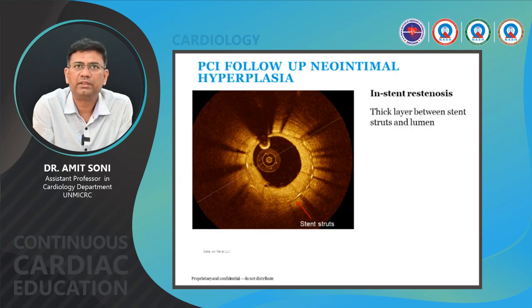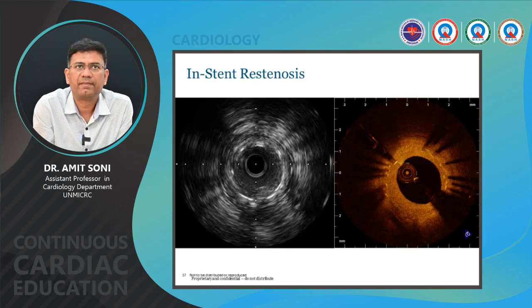In-stent restenosis: a thick layer between the stent and the lumen. So this is suggestive of in-stent restenosis. So this is another picture of in-stent restenosis, ISR.